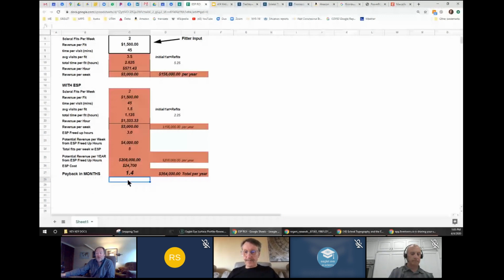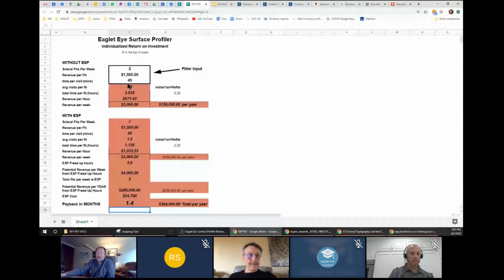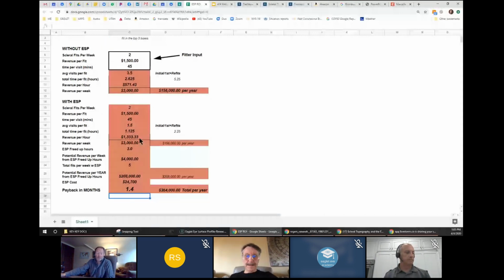Now, I will tell you there's going to be a little bit of a learning curve. So on day 1, are you going to jump from 3.5 fits to 1.5 fits per eye? I doubt it, but you'll be very quick. Barry or Ryan, do you want to jump in on what you think your average fit rate per eye is these days? It's really tough to say because I haven't really analyzed it. I'm not really statistically, mathematically minded, but we see patients less often. I think your figures on the reduction are probably about correct, but to be fair, I haven't actually analyzed it per se. I bet Barry has. Go on, Barry.